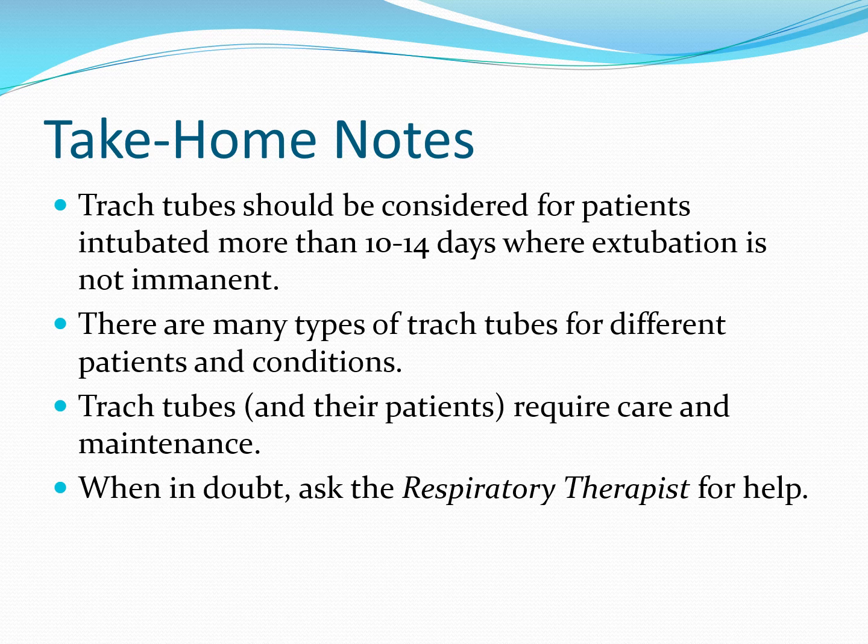So, simply put, it's a hole in the patient's throat. The normal humidification and filtration that happens, that's done by the nose, is not done as well. So there's considerations there. You don't get something for nothing. The patient gets the ability to breathe. If they're weaning, they can maybe wean better, but devil's in the details, and it needs to be done right. And when in doubt, ask a respiratory therapist for help.